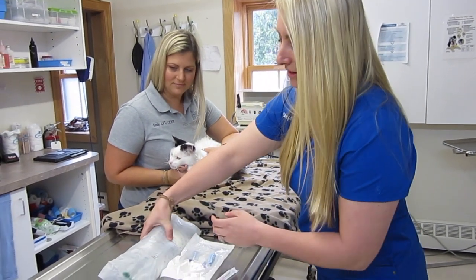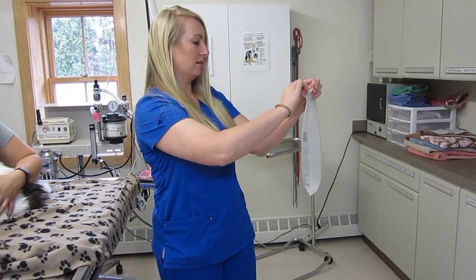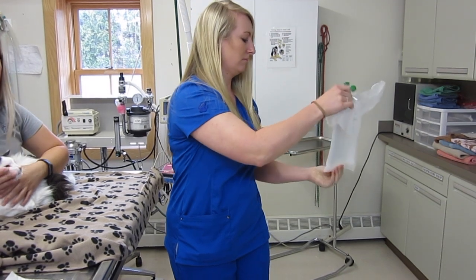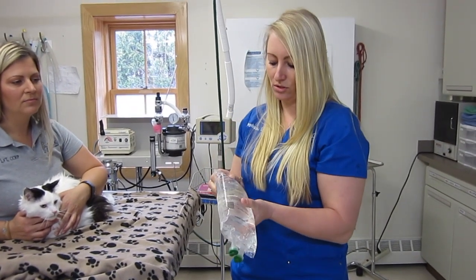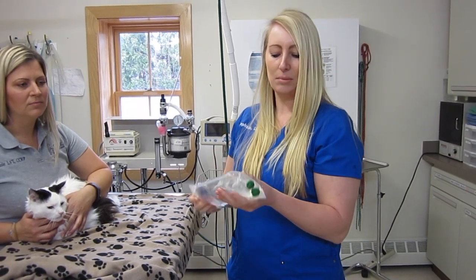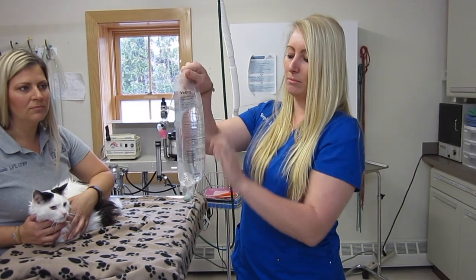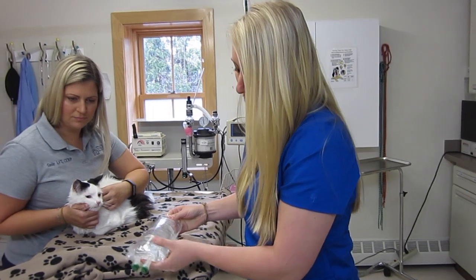So when you receive your bag at home, you want to start off by opening the bag. And depending on what type of fluids you get, we usually send home lactated ringers. The bags could be a little bit different from time to time, so just be aware when you are measuring the bag that it might be a little bit different. So you want to open your bag.